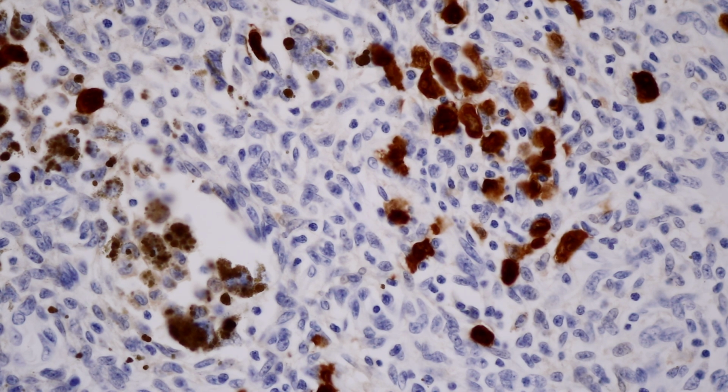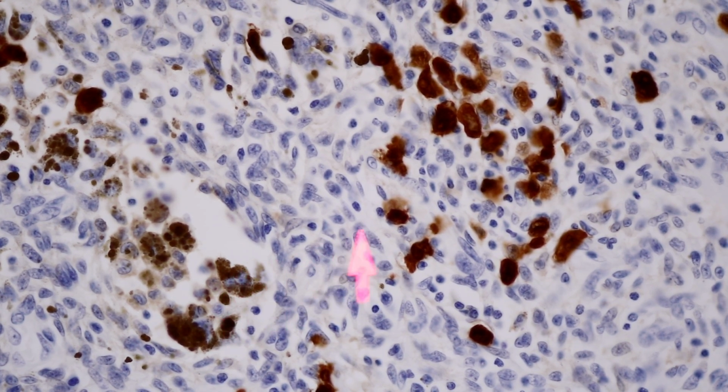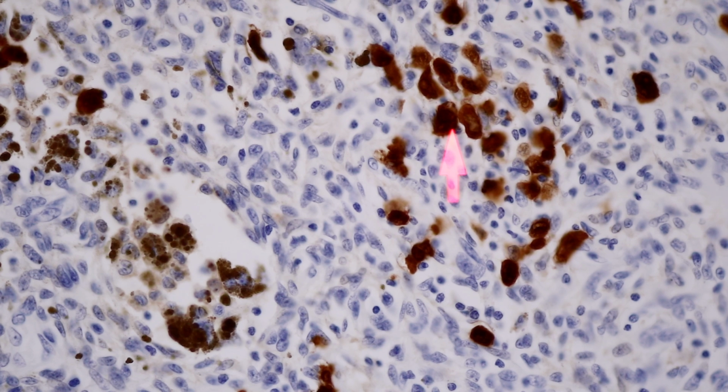So the second point I want to make is that even if you don't have a red chromogen and you're trying to tell apart melanin pigment or hemosiderin pigment from true staining, usually with some practice you can do that. It's harder to do, especially if you're looking at the pattern of immunostaining, but it can be done. And look, even on this video, you can see the color here in the background hemosiderin pigment is different than the color here. The DAB immunostain, we call it brown, but it to me has kind of an almost orangey red sort of brown look. And melanin is much more of a true brown.